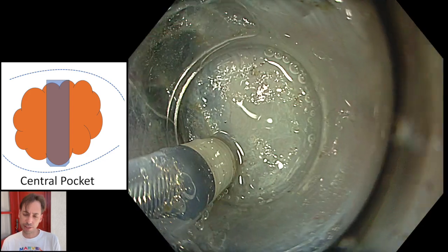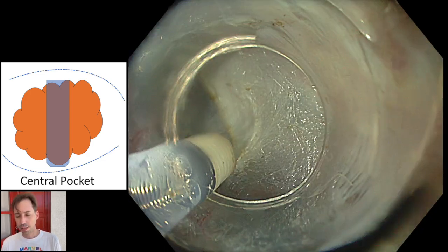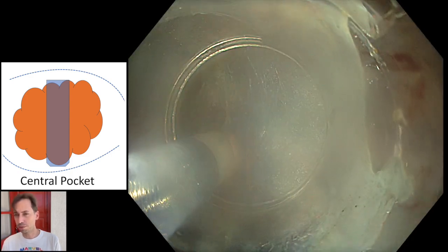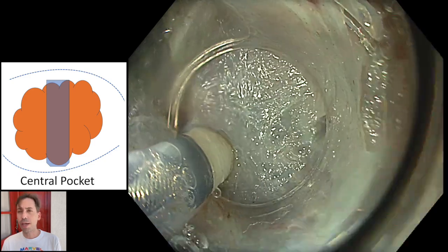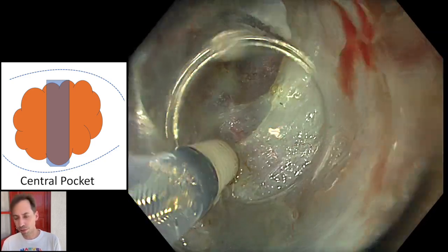However, it has a disadvantage, and this disadvantage is the creation of smoke, and the lens becomes very dirty quite soon, and you need to clean it from time to time. That's why I alternate this current with forced coagulation effect 3 from time to time.